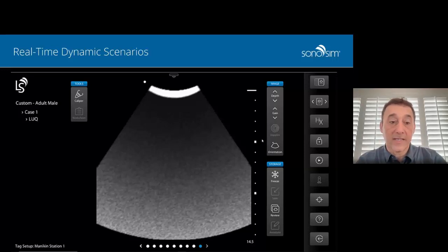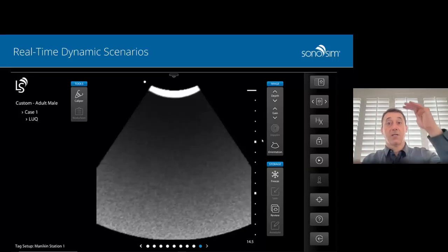This is the next feature that is super, super important and potentially the most important. Here, it's the ability to watch how a user goes through a case. So in this case, an 18-year-old with a gunshot wound to the left upper chest. Ideally, the user recognizes there's a left-sided pneumothorax and free fluid in the left upper quadrant and acts appropriately, which may be to give blood or put in a chest tube. And if you see that the learner's doing that, you can normalize the vital signs. You can take the heart rate and decrease it. You can take the respiratory rate and decrease it in response to what the patient does.